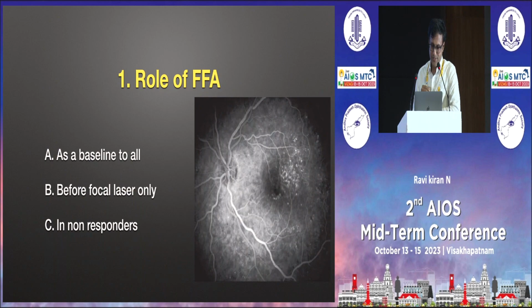My first question to the panel is: what is the role of FFA? Do we do this as a baseline in all patients presenting with DME, or just before the focal laser only to identify the leaking microaneurysms, or only in cases of non-responders?